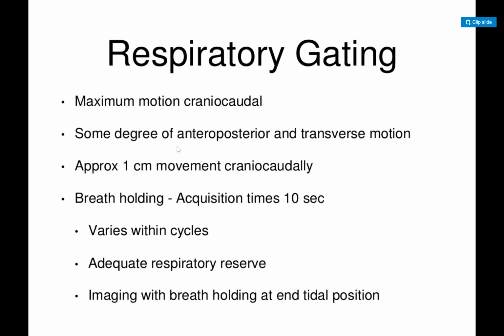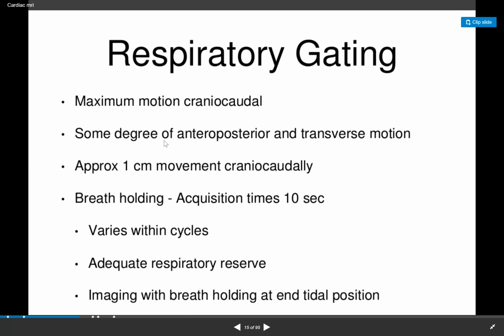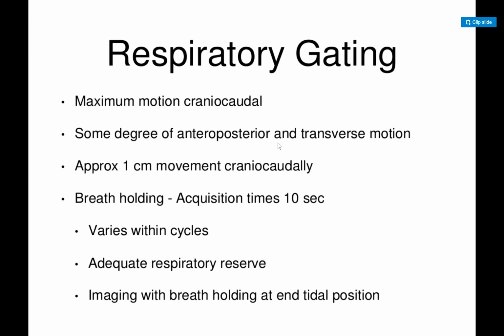And usually 10 to 15 seconds is what we need. That might be a lot for some of the patients who are short of breath, who cannot lay flat. In those patients, the images are distorted, they are not great. The reason for this is so that the diaphragm is staying still while you are taking these pictures. As you can see in the imaging with breath holding at the end tidal position, some of the patients, especially the kids who cannot hold breath, we might end up actually putting them under anesthesia and then doing the case. And anesthesia can make them stop breathing during that.